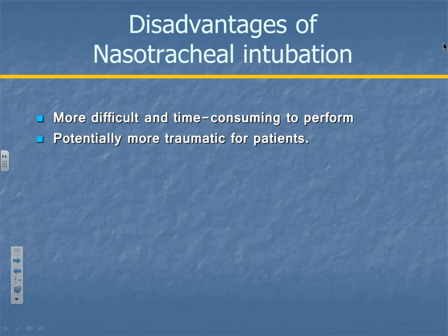Yeah, if you do some soft tissue damage there, the tissue in the nose is very delicate, and it also bleeds very easily, right? So if you're trying to poke that thing up and around, you increase the risk that you're going to do some soft tissue damage. So there are some issues there.